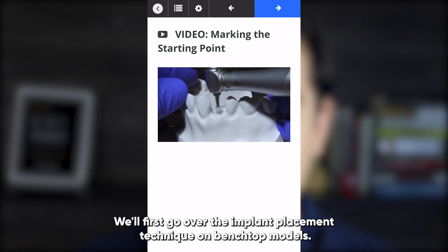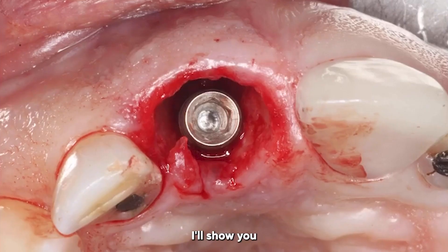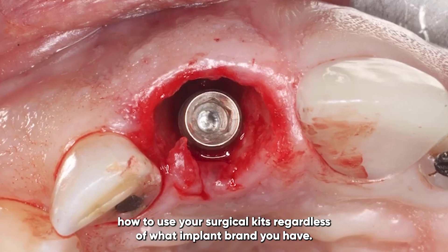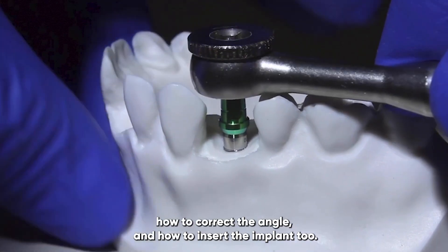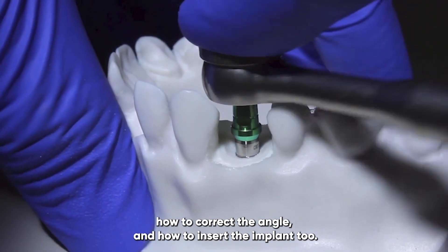We'll first go over the implant placement technique on benchtop models. I'll show you how to use your surgical kits regardless of what implant brand you have. You'll learn how to start your implant site, how to correct the angle, and how to insert the implant too.